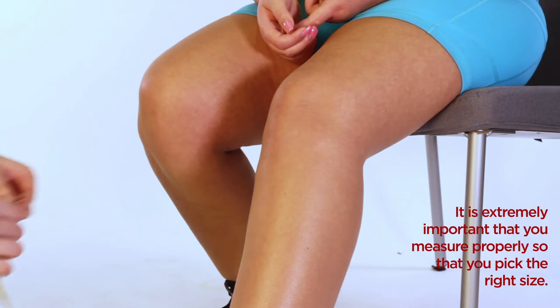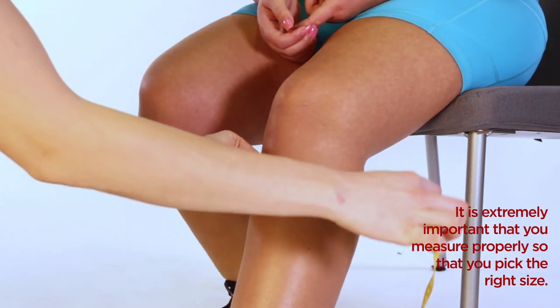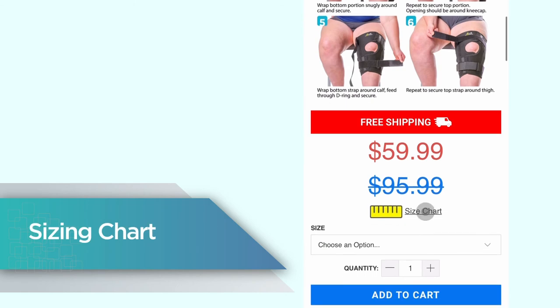With several sizes to choose from, it is extremely important that you measure properly so that you pick the right one. Braces are nothing like clothing, so you absolutely cannot guess your size. Please refer to our sizing chart.